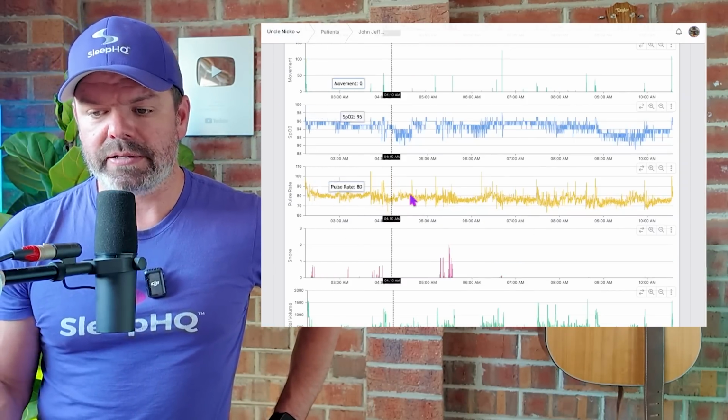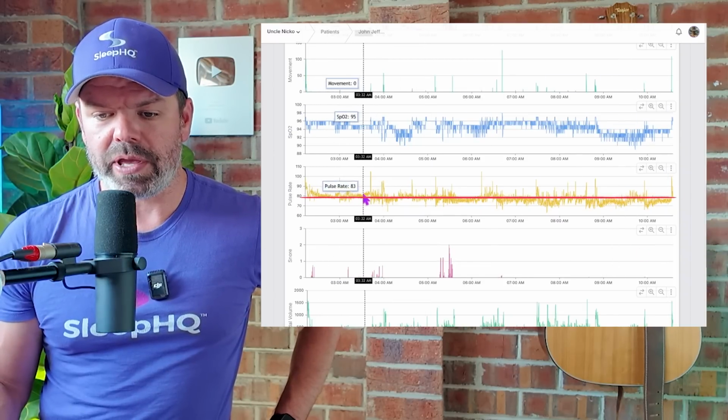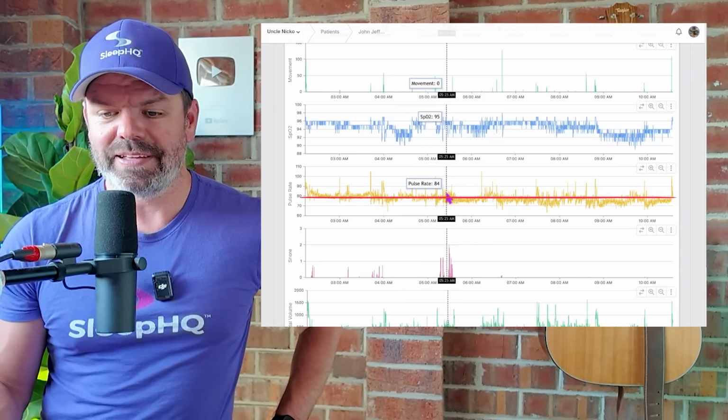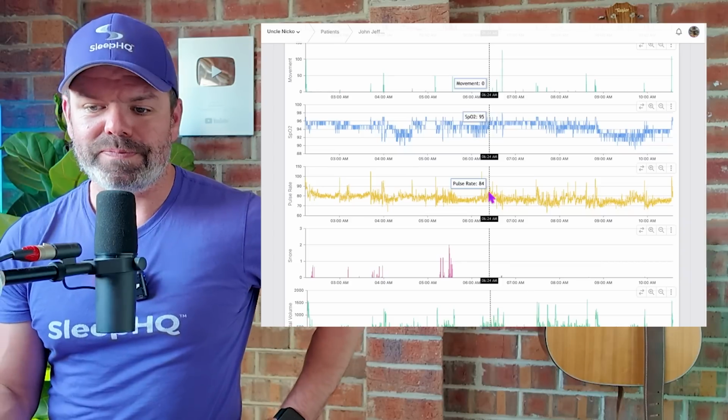You don't see it, hey. There's not really a drop. Hey, it's going up if anything. Look at it, just staying around that 80. Huh? See there? No pulse rate drop.